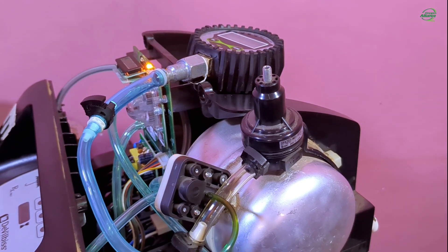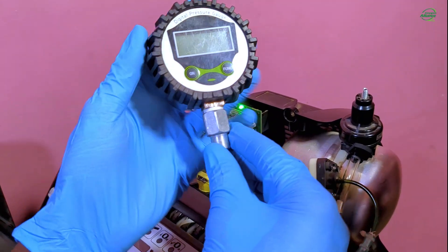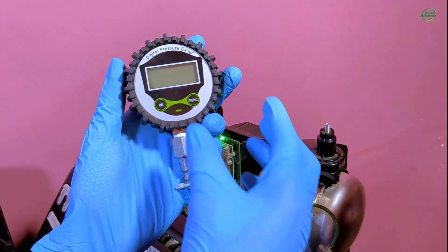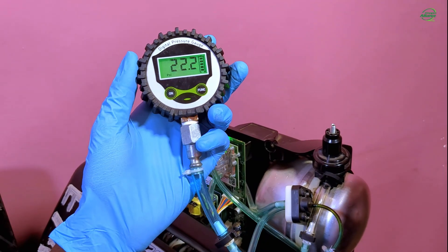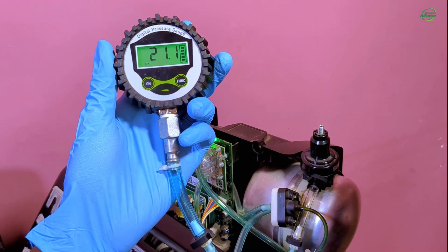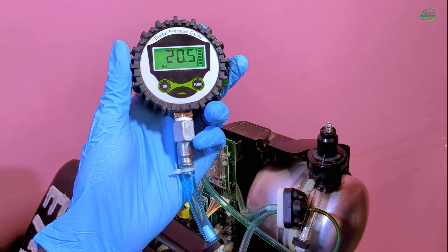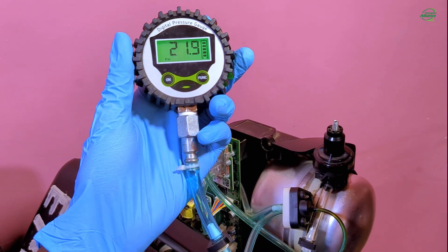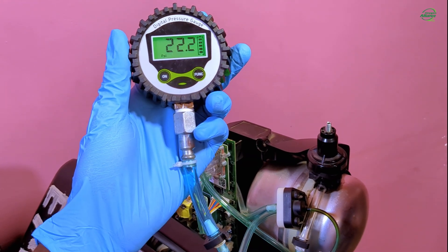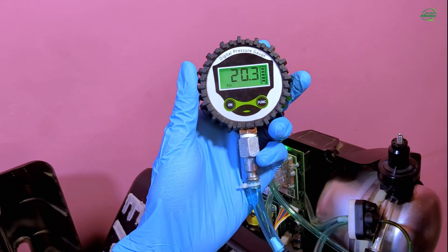Before starting to take the pressure readings, you have to wait for 5 minutes. Now I will turn on the gauge to observe the pressure readings in the accumulator tank. We expect that the pressure readings on the gauge will rise and fall, and therefore the high and low pressures have to be consistent. As you can see, our readings are ranging from 19.4 PSI to 22.2 PSI.